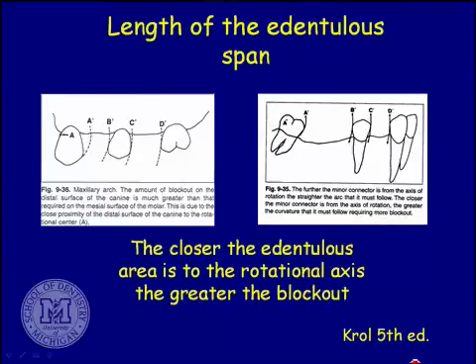This just looks at that one situation, saying if you're doing a front to back, like the upper picture that's a class 4 partial, and things are going to seat here first and then rock down distally, the shorter the span is, the more you've got to block out. And the further away you are, so the radius of arc that you're going on, as that gets longer, you've got less blockout because things are becoming more nearly vertical, whether that's upper or lower.